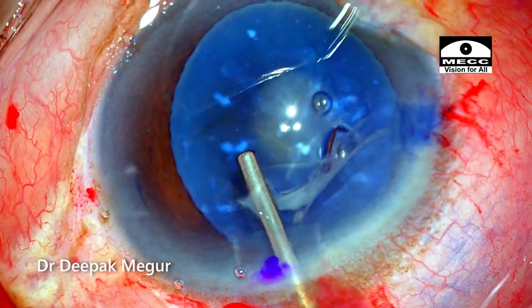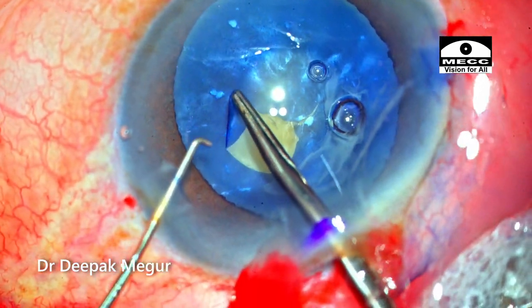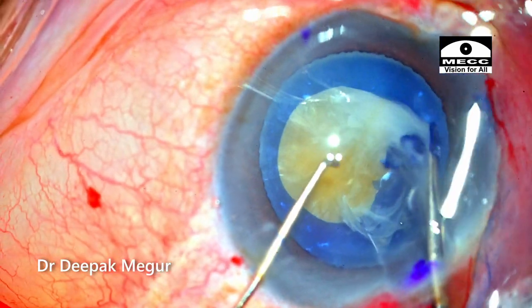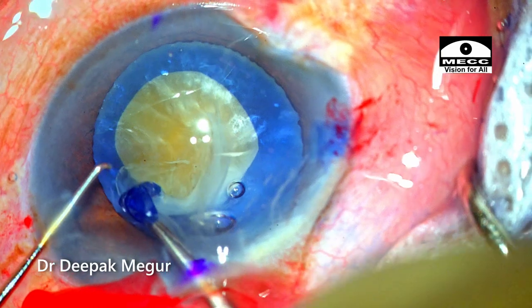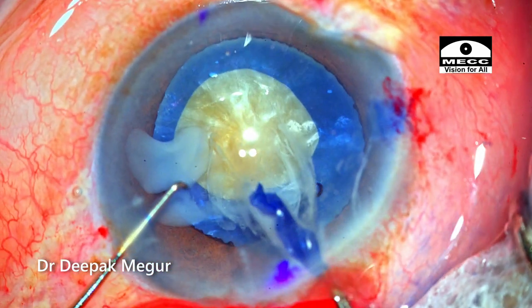OVD is refilled into the anterior chamber and the flap is held with the forceps and the rhexis is begun. Care is taken to avoid the calcified specks. Forceps give better control in such eyes where we're expecting loose zonules. As the rhexis is completed, I realize that the size of the rhexis could be smaller to deal with these dense, bulky nucleus.